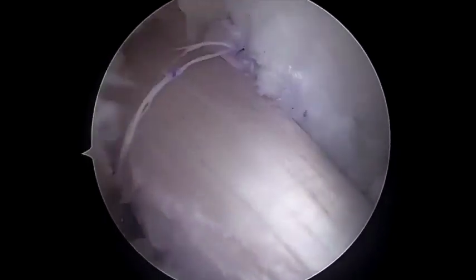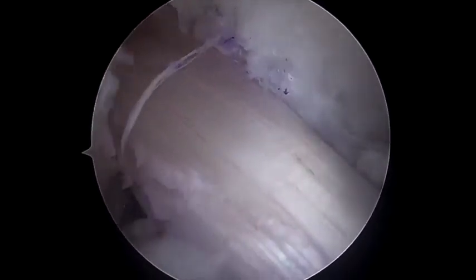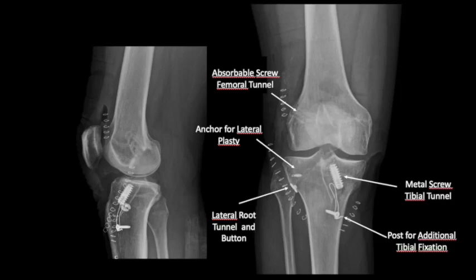The graft is fixed onto the tibia using a metal screw and onto the femur using an interference screw. Additional tibial fixation can be performed by tying the metal wire carried on the bone plug to a monocortical screw which acts as a post.